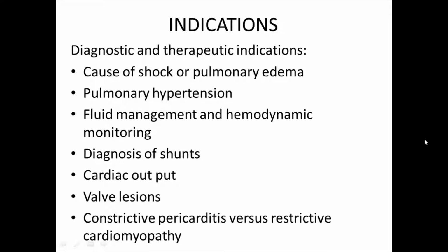Also to study pulmonary hypertension and its severity. One of the major indications is to guide fluid management and hemodynamic monitoring, especially after cardiac surgery, after complicated myocardial infarction, or in cardiogenic shock.